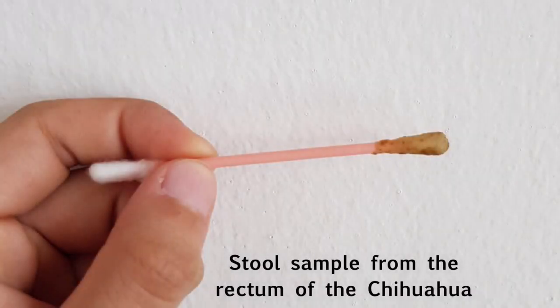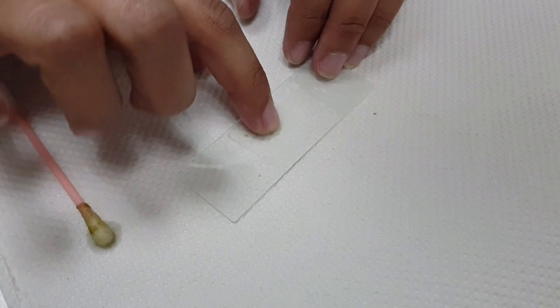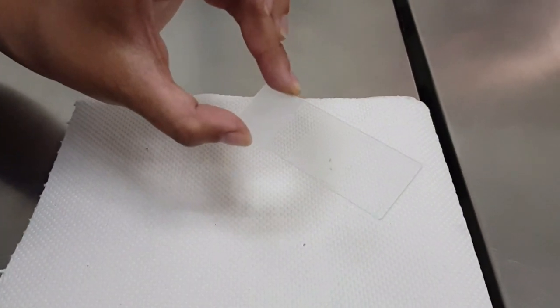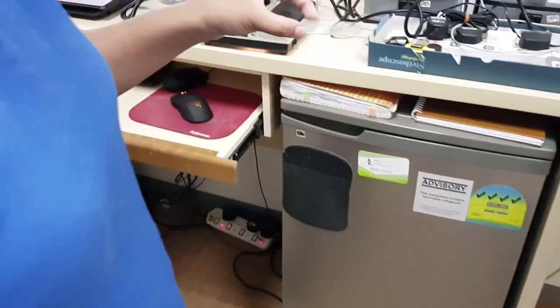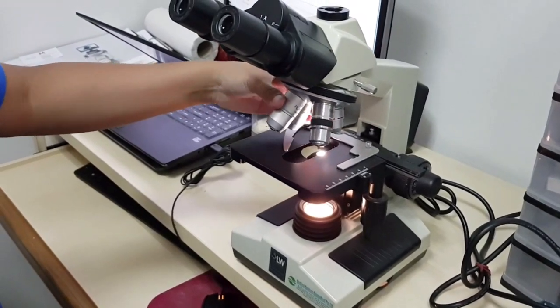First, a stool sample is needed, and the vet will use a cotton bud to take it from the patient's rectum. Secondly, he will smear the stool sample onto a microscopic slide and place a cover slip over it. He will then place the stool sample under a microscope for observation.